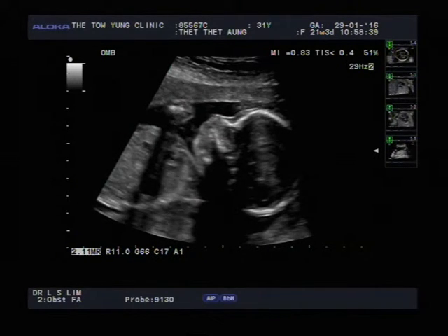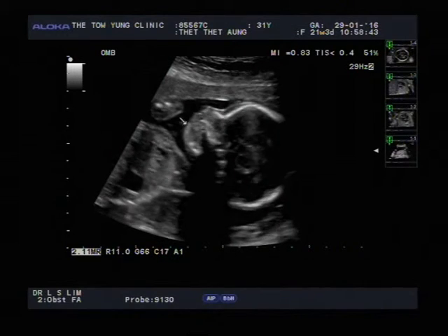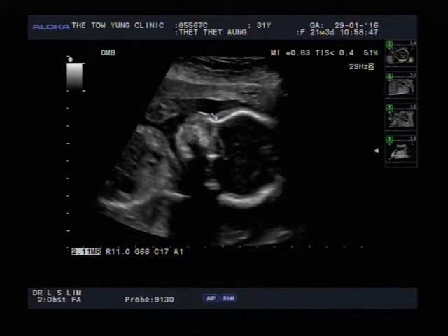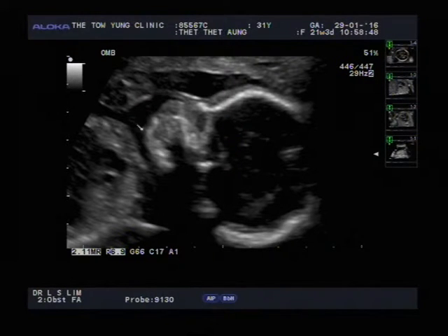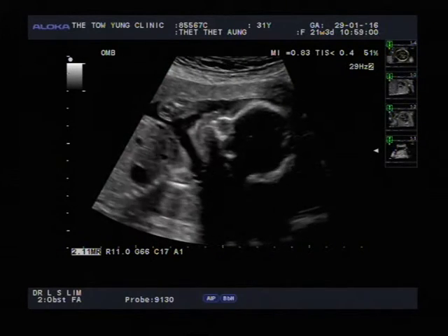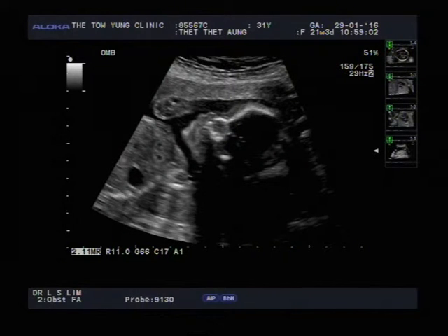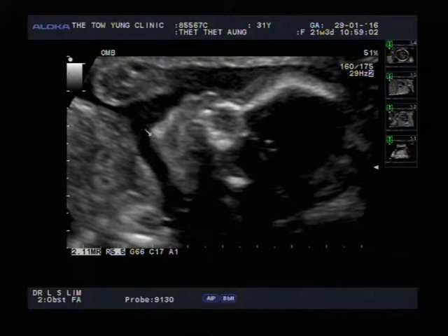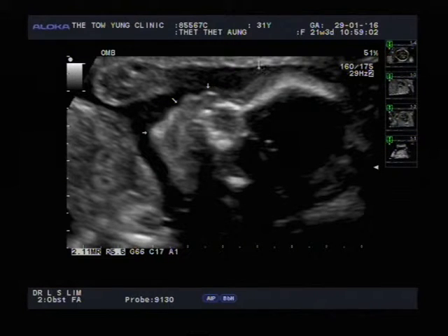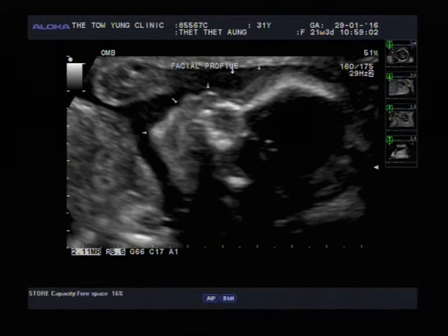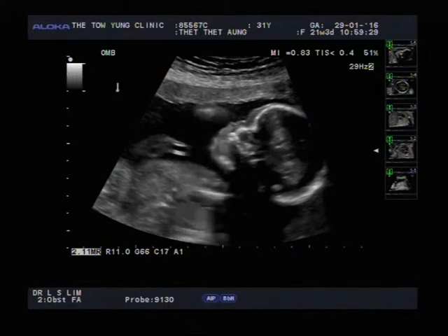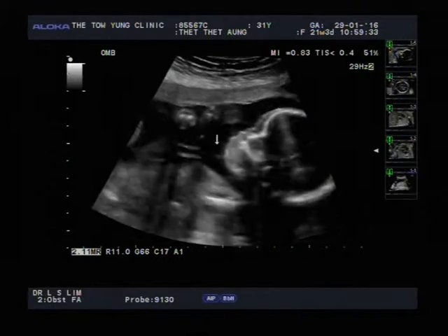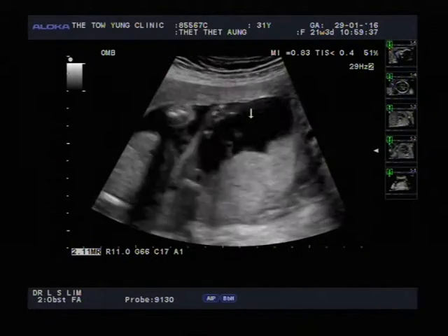Here again you can see the face profile. The mouth is over here and the nose is on top. In this view of the face profile — the nose, forehead, mouth, and chin. The chin is over here, the mouth here, and the nose and forehead are over here — we call this the face profile. The baby is looking at the top of the screen. You can see the mouth moving — the nose is there — and there's a hand coming in front of the face.